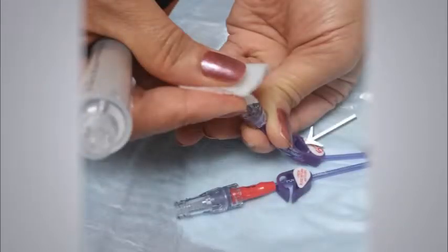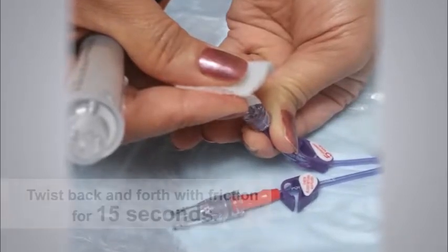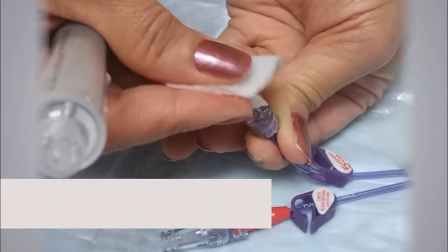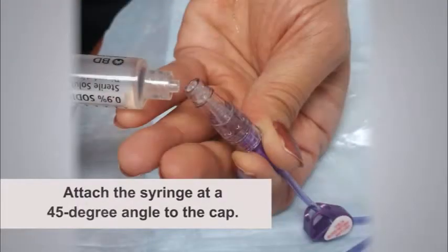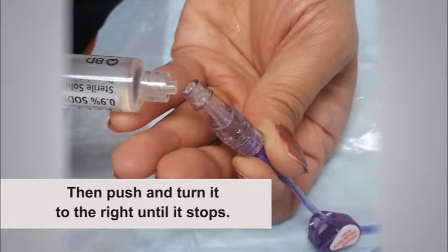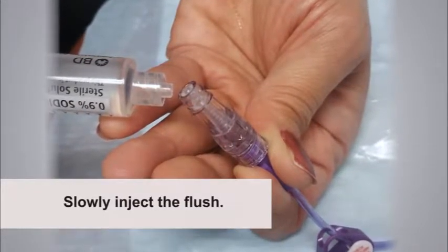Make sure the catheter clamp is open. Now scrub the top of the connector cap with the antiseptic pad. Twist back and forth with friction for 15 seconds. Air dry for 30 seconds. Attach the syringe at a 45-degree angle to the cap. Then push and turn it to the right until it stops. Slowly inject the flush.